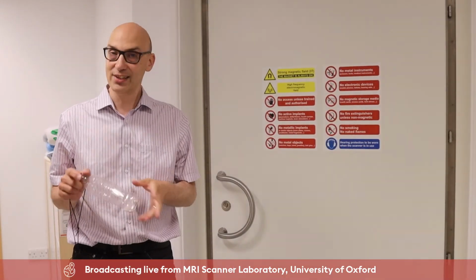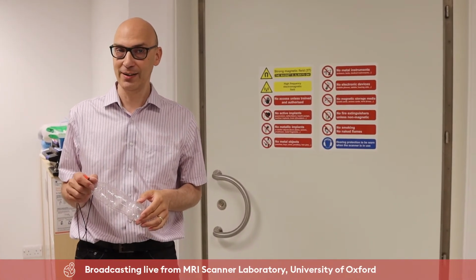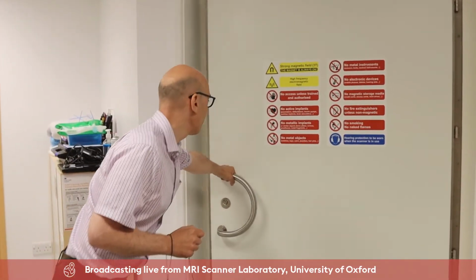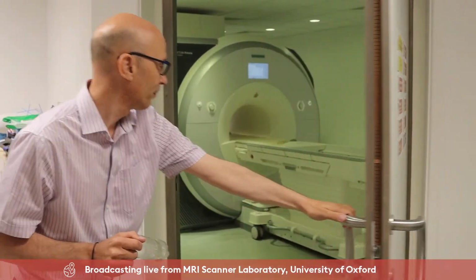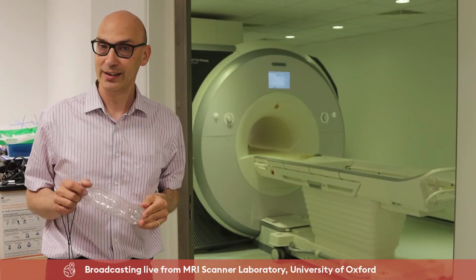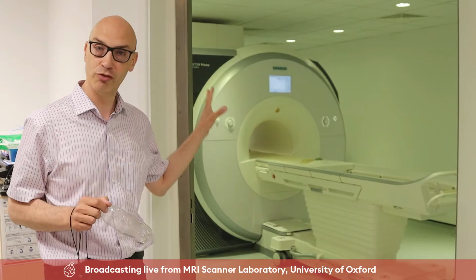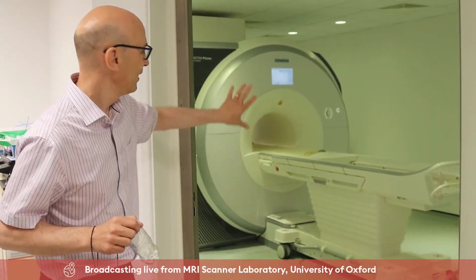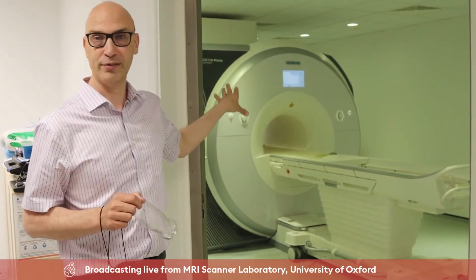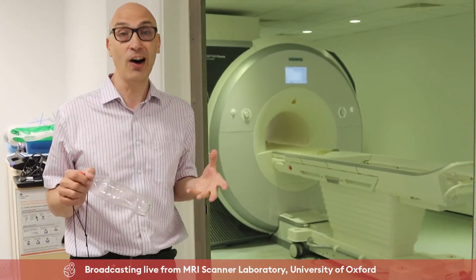So we're standing inside the control room of the MRI scanner at Oxford University. And inside there is the MRI scanner. Let's take a look inside. MRI stands for magnetic resonance imaging, and it uses a really strong magnet. This is not like a magnet that you just find on your fridge. This is 12 tons of magnet. It is incredibly strong. It could pick up a car.